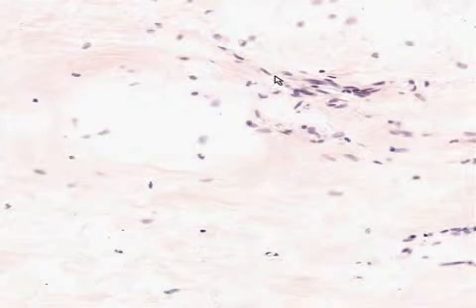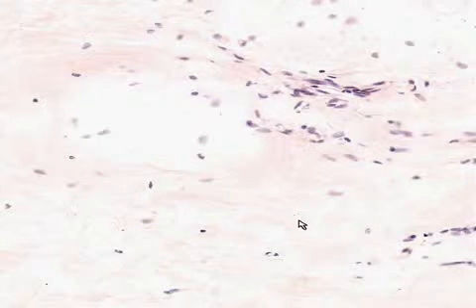A general rule of thumb is that every spindly looking cell within connective tissue of any type is a fibroblast until proven otherwise. Loose connective tissue is more likely to have other types of cells, however.